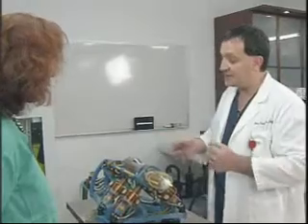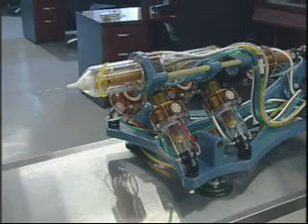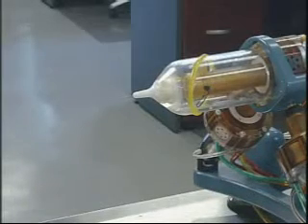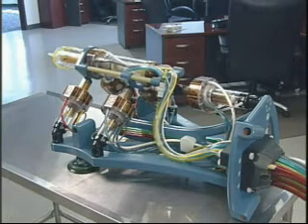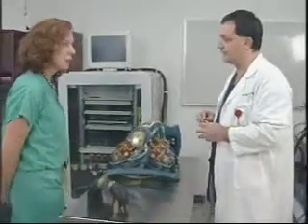To do a plastic robot, we had to make a new kind of motors. And these are air-driven motors, which are also precise. Air motors exist, but this one can do precise motion, which was not possible before this achievement. So this motor allows you then to place the biopsy needle very precisely.